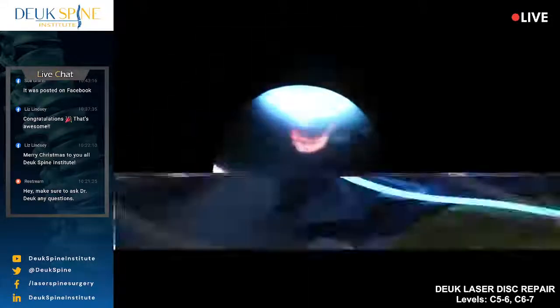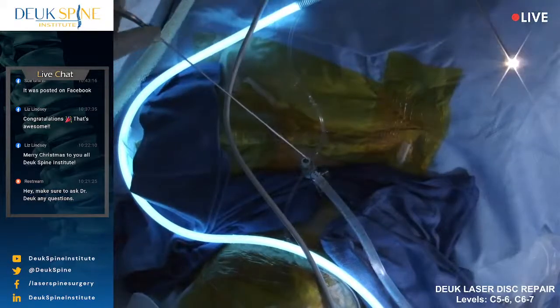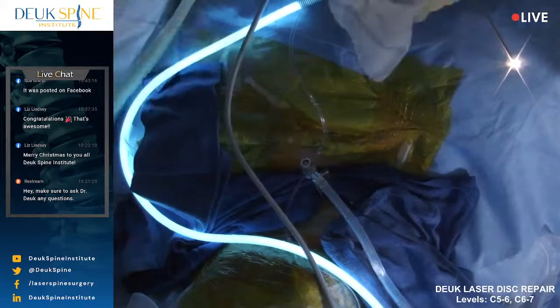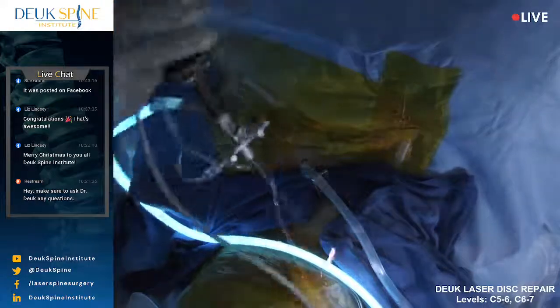All right, there's a big herniation there. I got to go grab it out. So you see how the surgery is a combination of laser debridement with removing larger pieces using the grabbers. That's a good size. That one was about 3 millimeter by 2 millimeter.